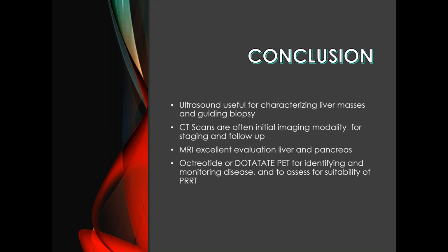Okay, great. So we have a number of questions left and not too much time. So let me just scroll here. Next one is this individual has viewed several CT reports. It appears that there is not a standard for tumor definition. Why? I'm not sure I understand what they mean by a standard tumor definition.